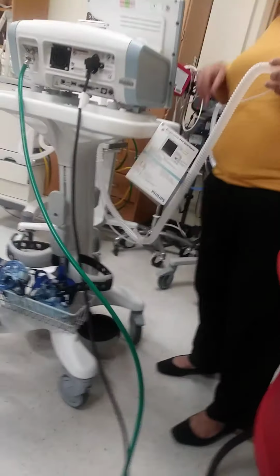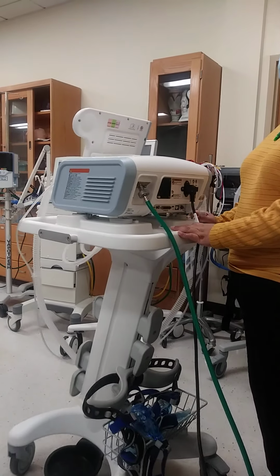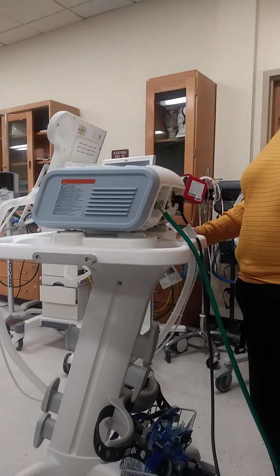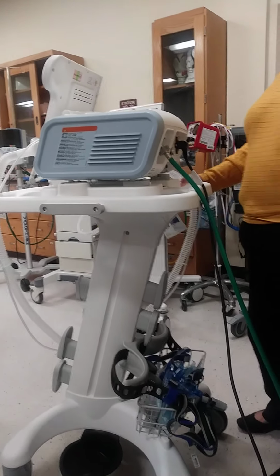Okay, so your machine will not work without the oxygen. Now the nice thing about this machine is that it has a backup battery. So if you don't plug it in, it's going to tell you it's running on the backup battery, okay? And it will alarm and tell you that.